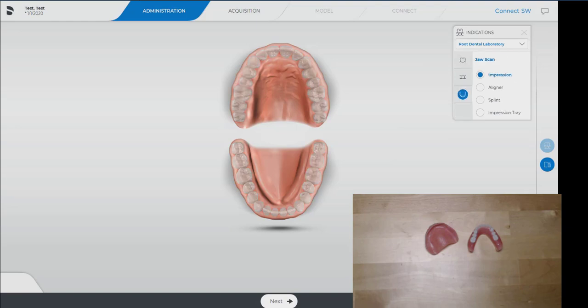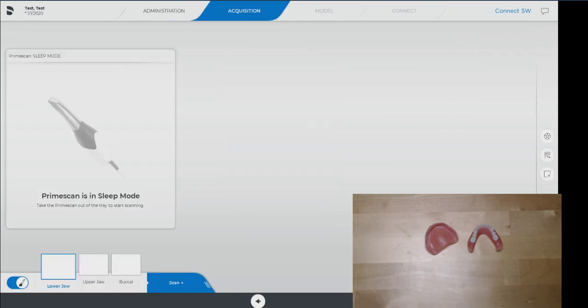We're going to go to jaw scan, impression, and then we're going to get ready to scan.